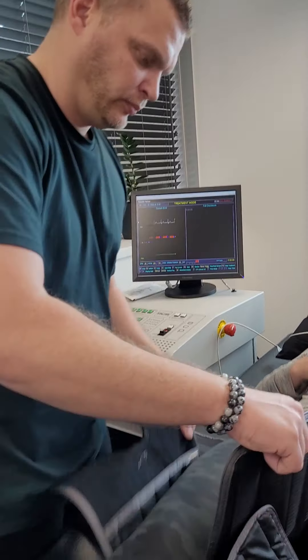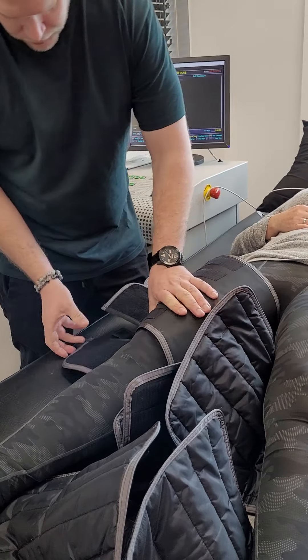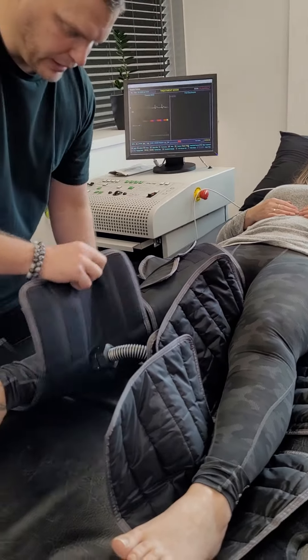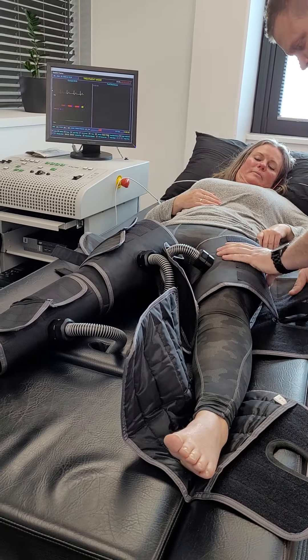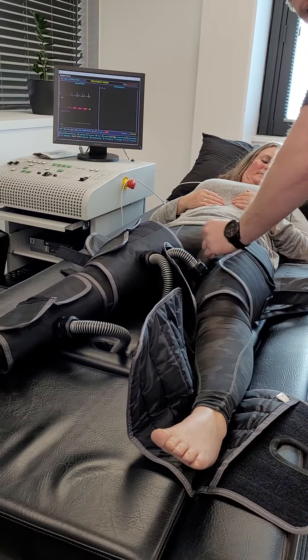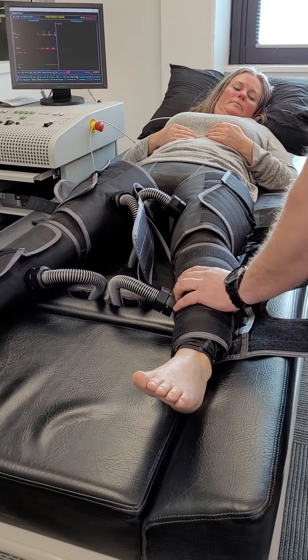Now we're going to strap up. Can you just turn the three green buttons on? Strip the thigh first. Half up. The other thigh. Up.